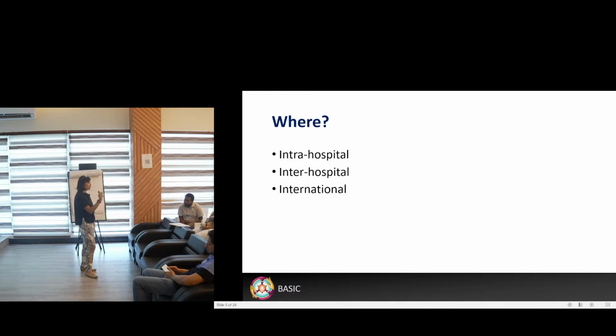We have a little transport bag as well. Anytime we leave the ICU, it's a mini bag that has a little bit of basic equipment, like an ambu bag, a little laryngoscope blade, a bougie and a spare tube, and it also has some emergency resus drugs like the small ampoule of adrenaline, and a couple of those drugs in there as well.